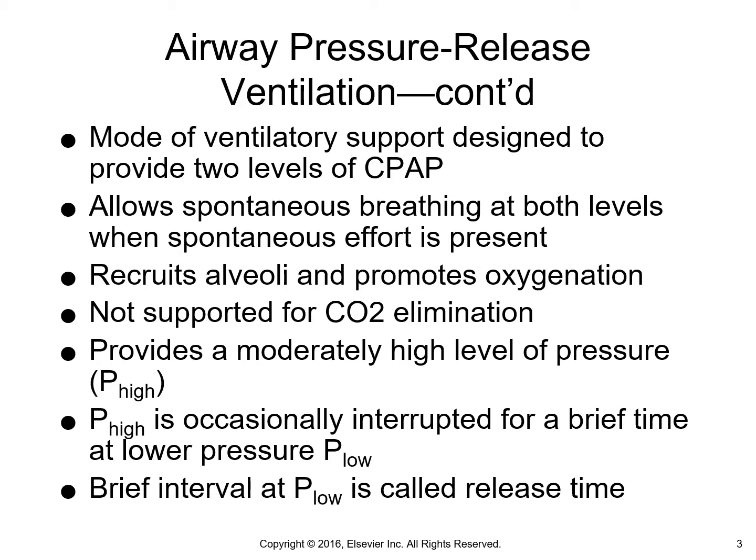The main goal is to recruit alveoli and promote oxygenation. It's not really quite as much used for CO2 elimination. We get into situations where we do allow permissive hypercapnia, especially with severe, very inverted I:E ratios. You may end up having to settle for pHs. They generally try to keep them above 7.20.